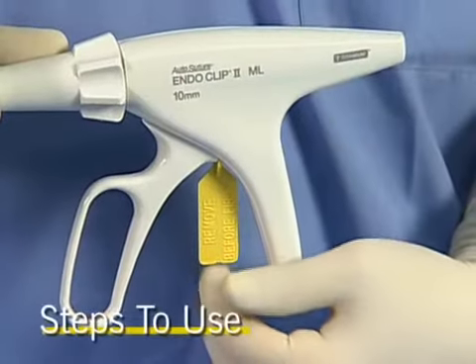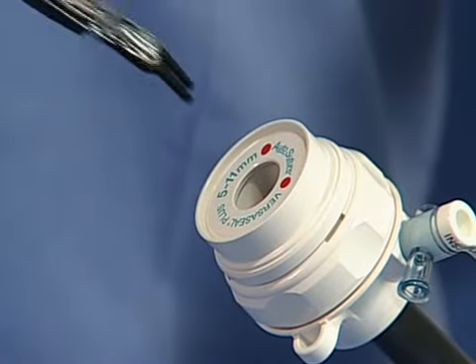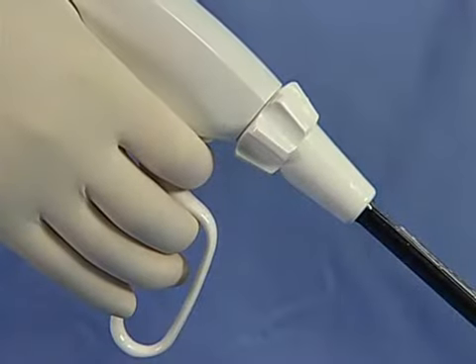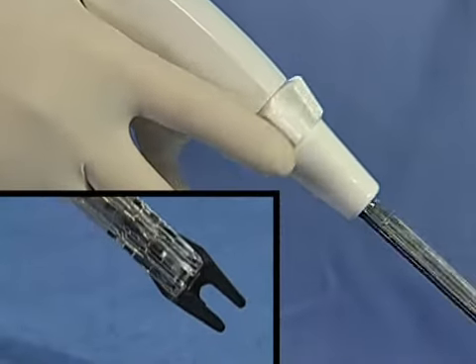The 10mm EndoClips are shipped sterile. Steps to use. Remove the yellow safety tab from the handle trigger joint. Introduce the applier through an appropriately sized trocar. Adjust the instrument jaw for maximum visibility by turning the rotation knob 360 degrees in either direction.